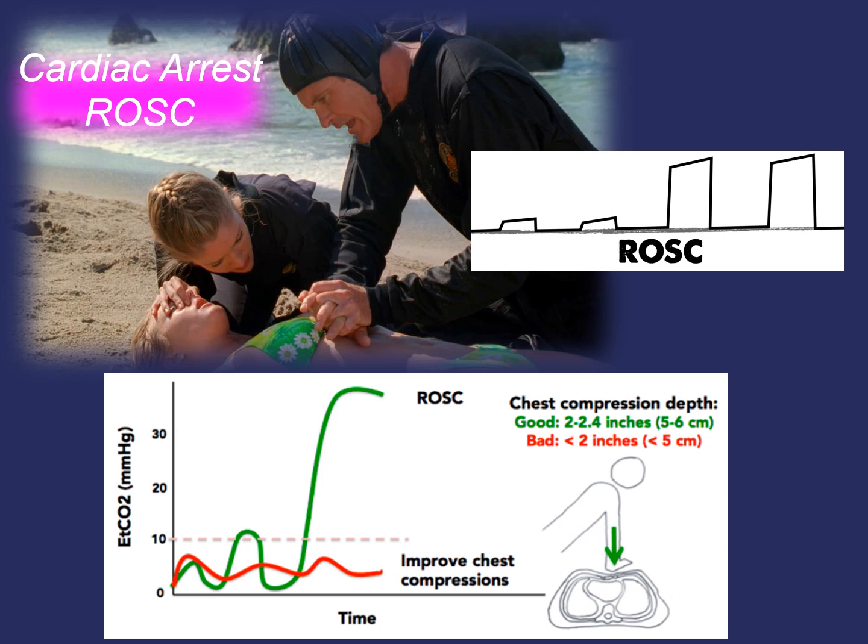While the pulse may be palpable and you have obtained vital signs, continue to watch that end-tidal CO2 value. One of the first signs of a patient rearresting can be seen when the end-tidal begins to decline despite attempts to correct. If end-tidal CO2 is abruptly lost, the first thing you should do is check for a pulse and intervene accordingly. Waveform capnography provides real-time information about perfusion and ventilation. This information provided before, during, and after cardiac arrest should be utilized to make clinical decisions about what to do next for this patient.